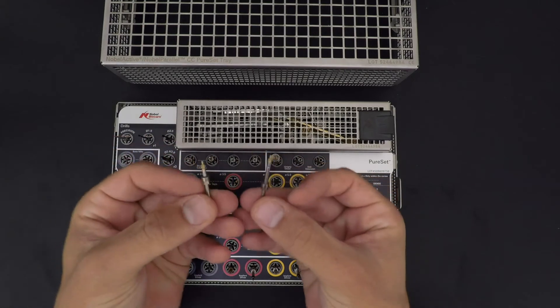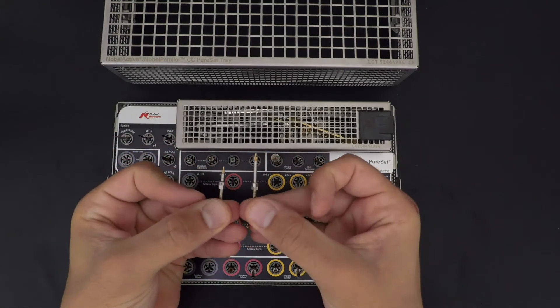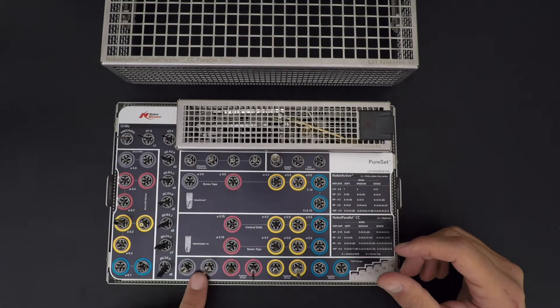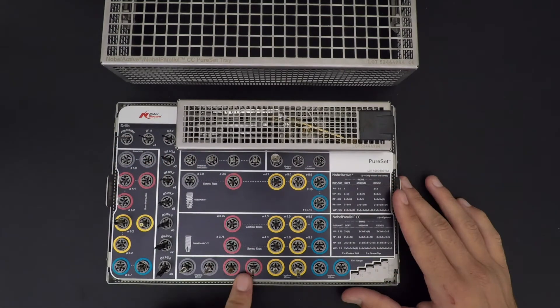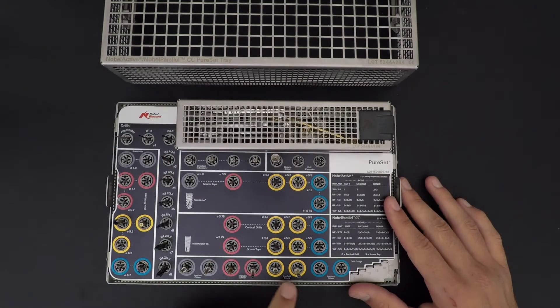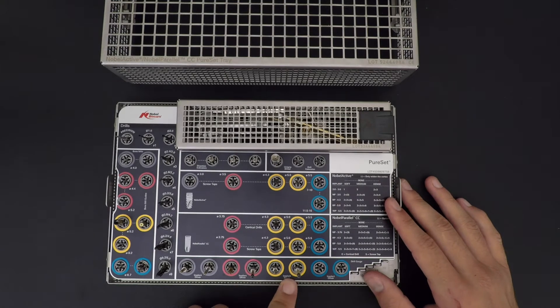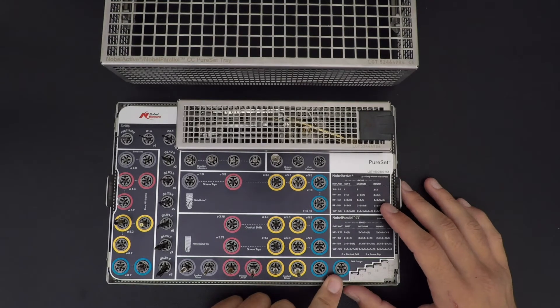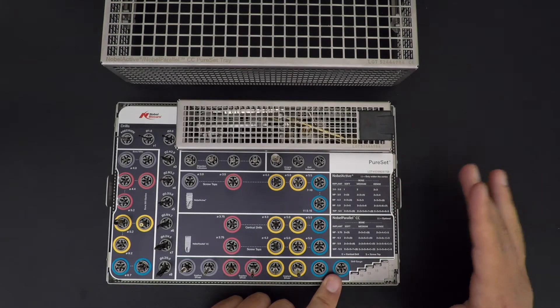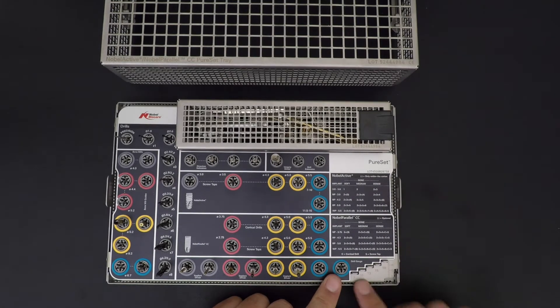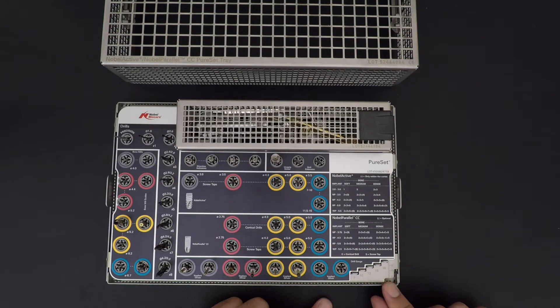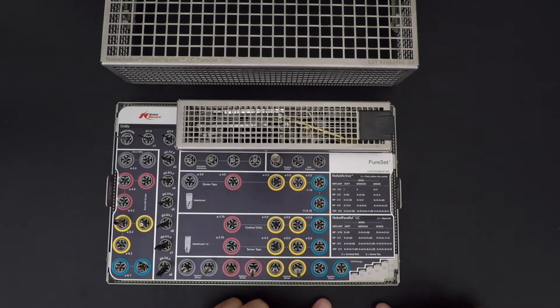3.0 narrow platform, regular platform, wide platform - still the same color code. At the bottom here, I really like this thing: sometimes you don't really remember which drill you have, how long they are, is it a 7 to 15, is it 7 to 18.